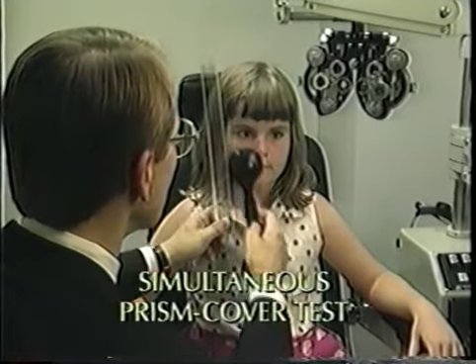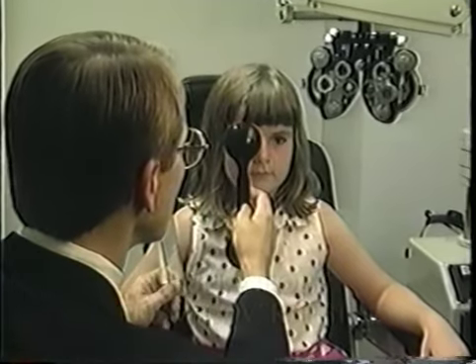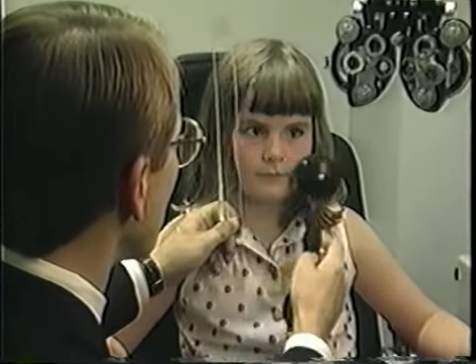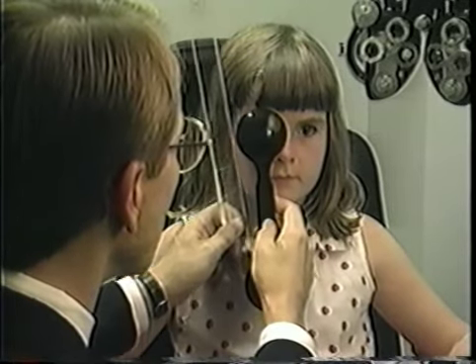As with other cover tests, the validity of the findings is directly related to the ability of the patient to maintain constant fixation on an accommodative target. Place the cover over the fixating eye and at the same time place a prism in front of the deviating eye. Repeat the test using larger prism powers until there is no shift in the deviated eye.